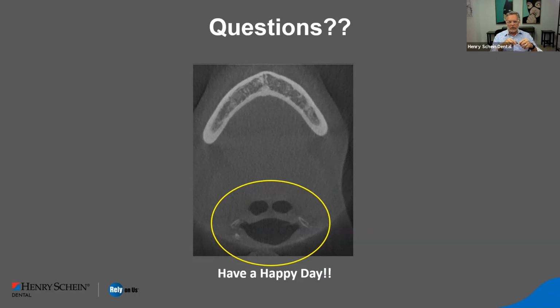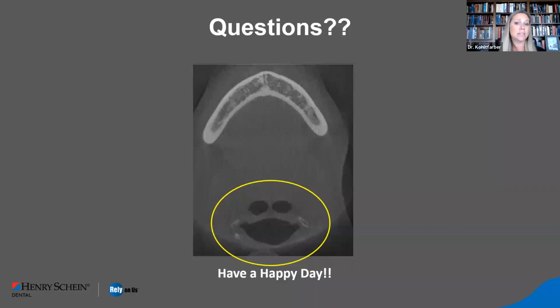So the automatic is more of a step towards the AI function, right? That everybody is hoping for. Right. And the difficulty with that comes into the fact that our CBCTs don't have true density like a medical CT would. Medical CT is going to be much, much more accurate than our cone-beam CTs. And that's inherent with the physics and the difference between a medical CT versus a cone-beam CT.